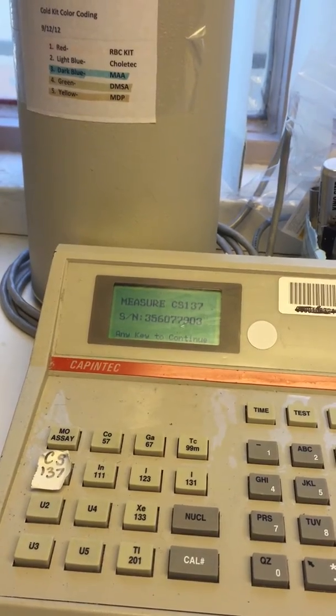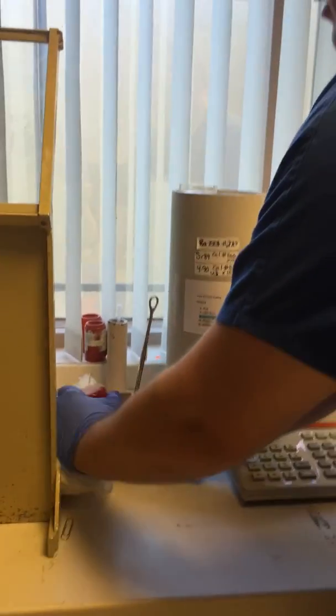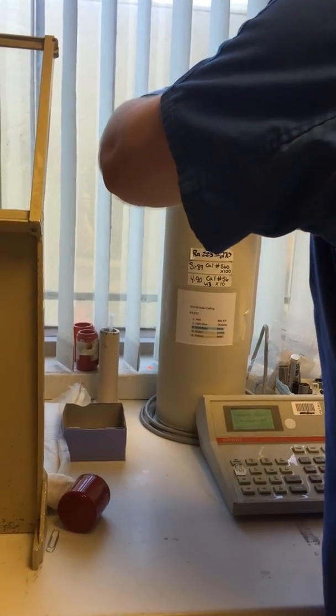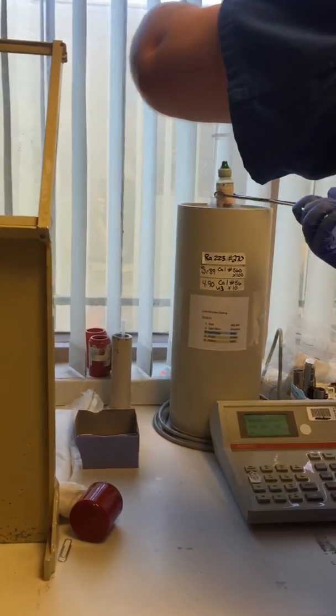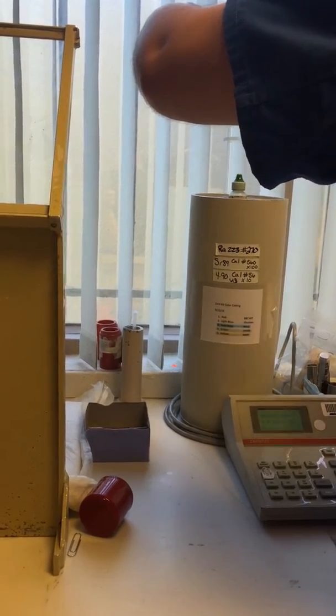Okay, now we're going to put the cesium-137 source into the dose calibrator. Okay, now we're going to use our tongs, just to be safe. Make sure it's right in the middle. Push enter.